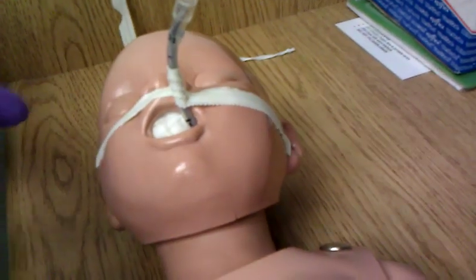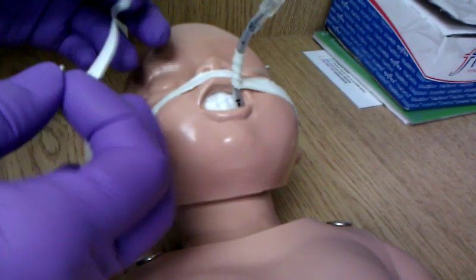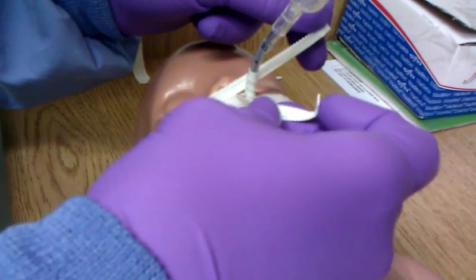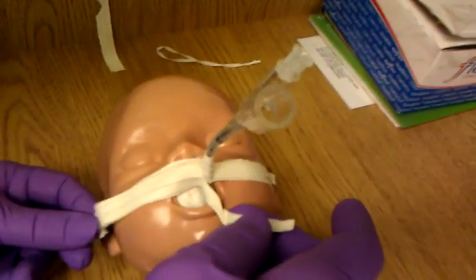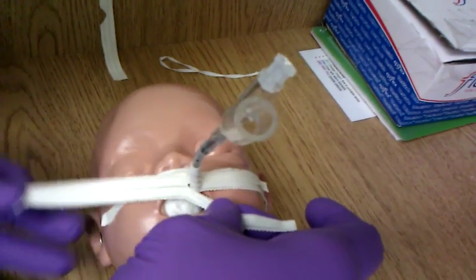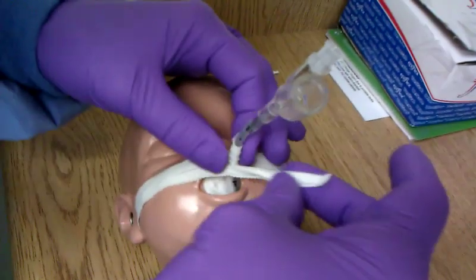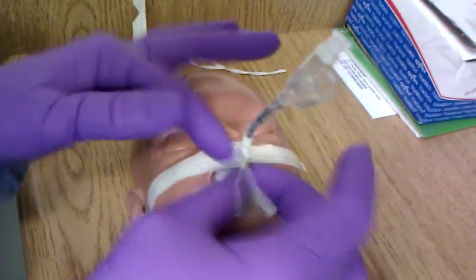And you're going to take the other piece of tape. Again, very close, right up against it, going around nice and tight.